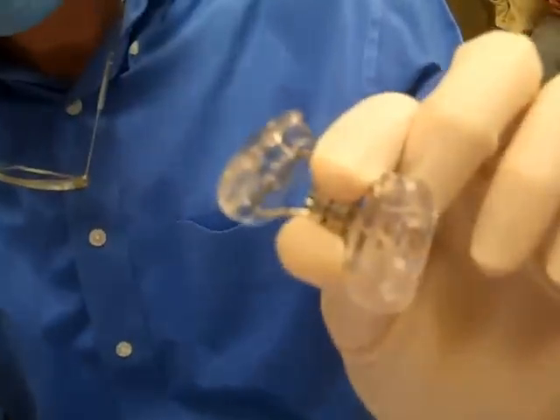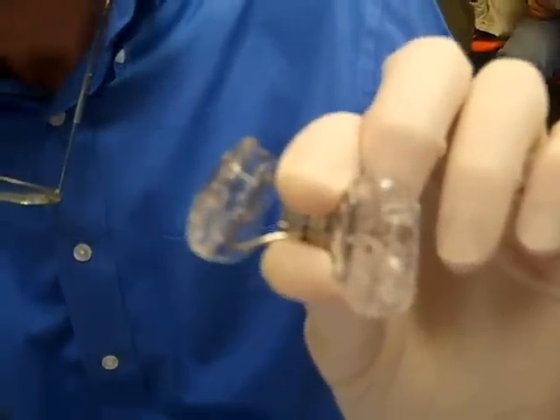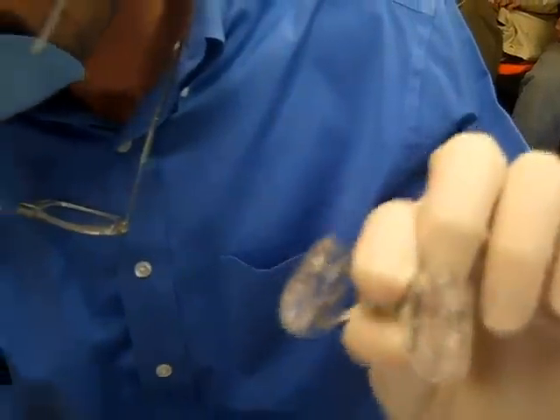This is the appliance right here — Karen's going to zoom in. This is called a bonded expander, bonded meaning it will be glued in her mouth. Logan's going to show us how easy this is today. It's really a piece of cake, so we're going to get started right now, and Jejet's going to be helping us here.